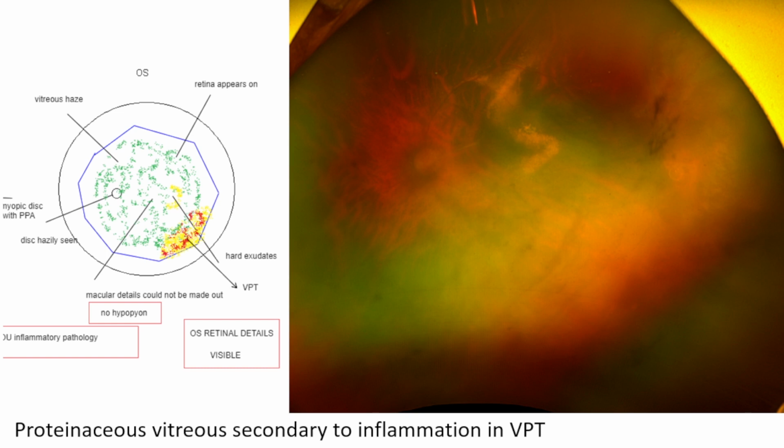So this case was referred as post-op endophthalmitis. It was looking like that, with haze, but this exudation, something felt off. I would have advised vitrectomy on the same day, but for the proteinaceous hue of the vitreous. That's what sir taught, and I should thank sir for diagnosing and helping with this case. So in any case, even if it is a post-op endophthalmitis suspect, if you feel something is off, please examine the patient again properly. Despite the ultrasound, I thought it was a subretinal abscess and I missed it actually.